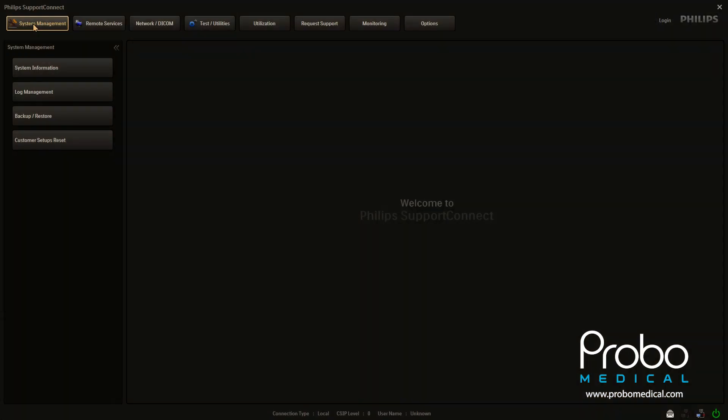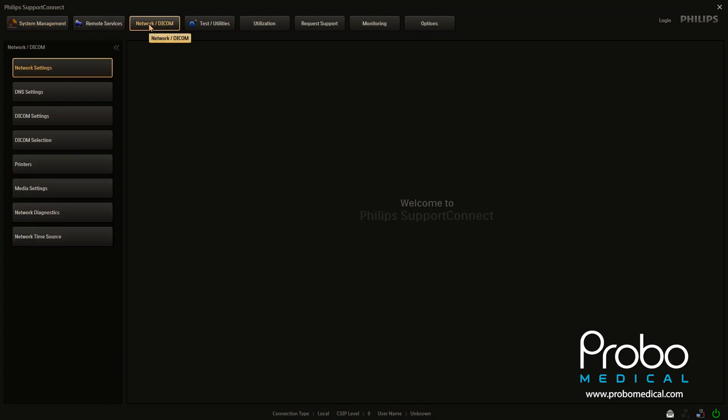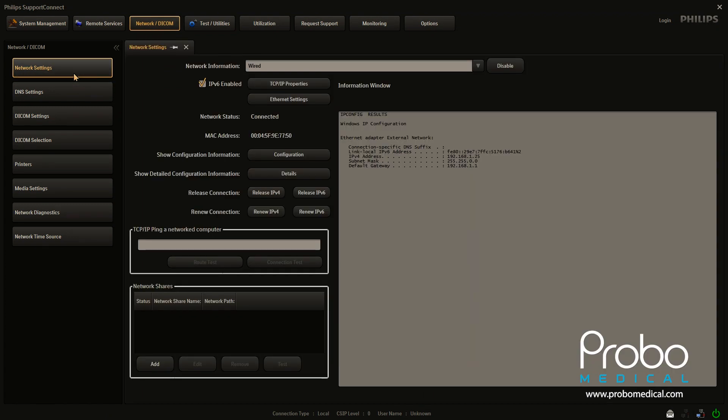Okay. So now that we are in support, we're going to slide over here to network DICOM. And first, we're going to go to network settings. So if your machine's already networked on a network, then you won't need to come in here, obviously.